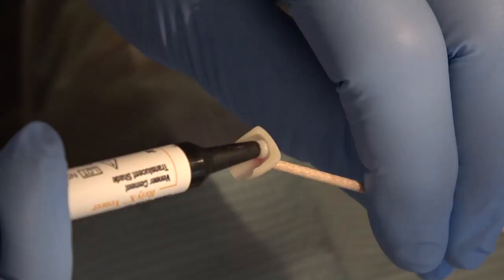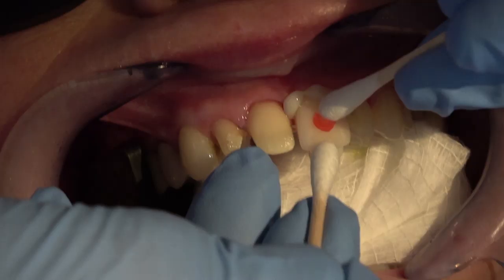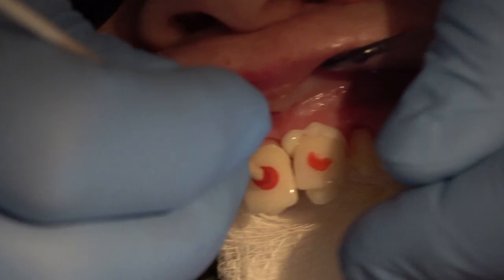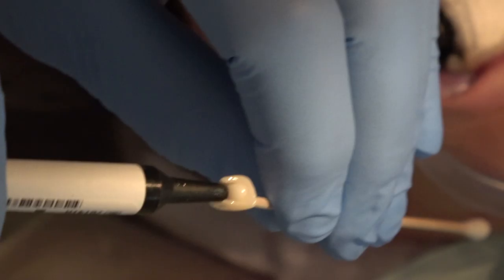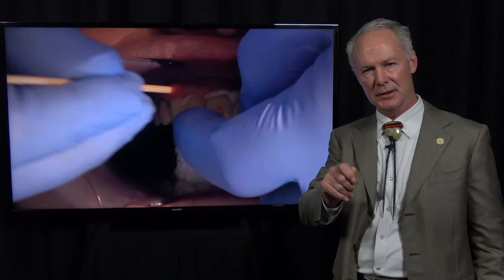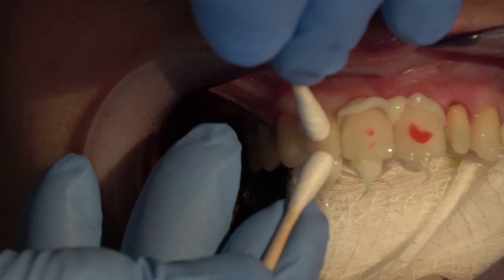So then I'm placing the Relax veneer luting composite into the veneer, putting it into place with cotton tip applicators, pressing it to place. We put them all on at the same time. Don't put them one at a time. I've never understood why people would put them on one at a time, because you're going to have to cure it, then you're going to have to remove the excess, it's going to be bleeding. The veneers might swim just the tiniest little bit. If you put them on all at the same time, they line each other up. They orient the adjacent veneers. So I always put them all on at the same time. You'll love veneers if you put them all on at the same time.